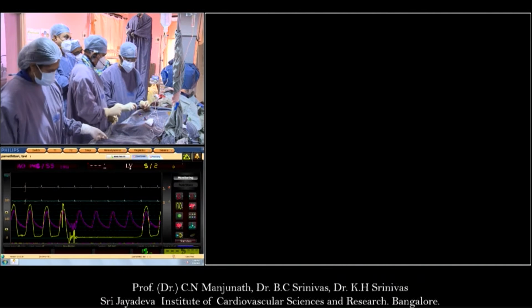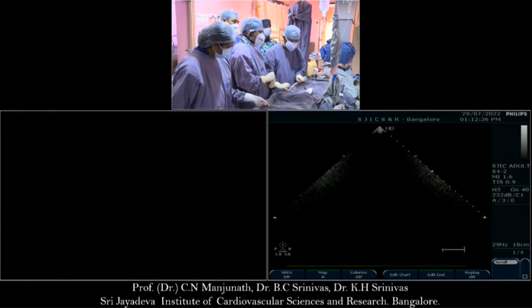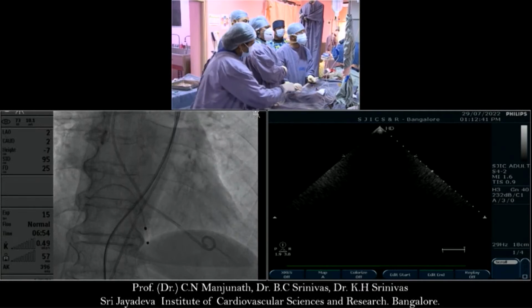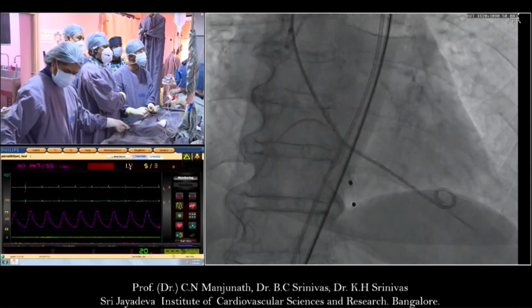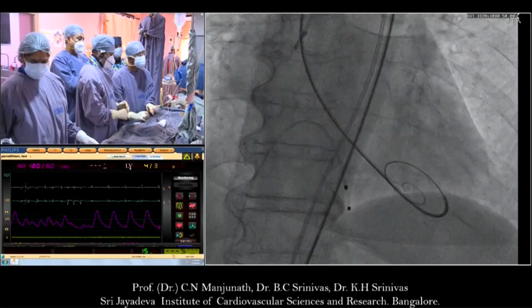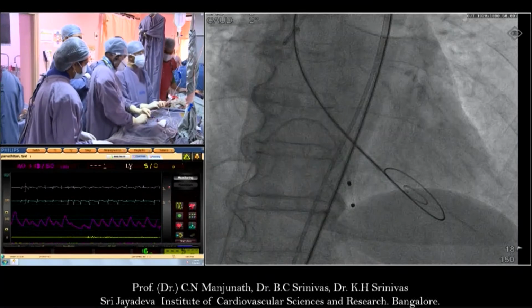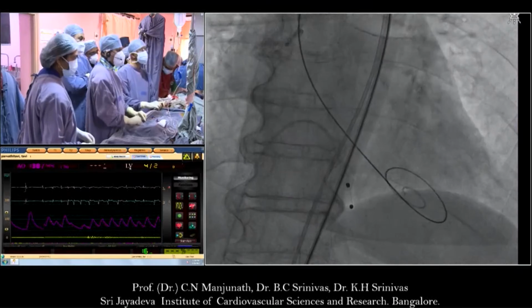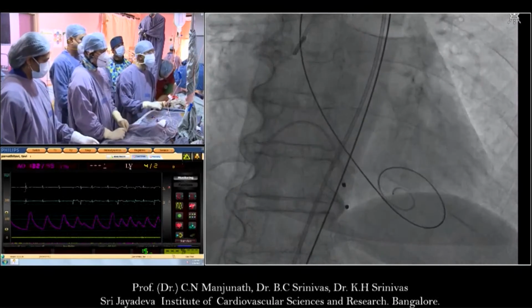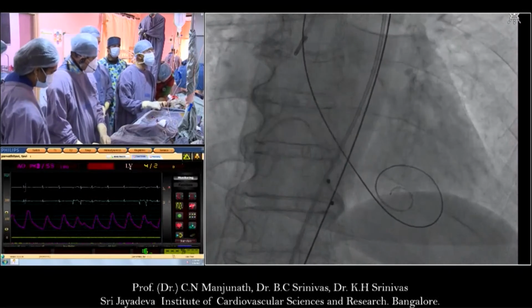Sorry, Ramesh, go ahead. Yeah, go ahead, Sushil, sorry. No, I'm just saying I think the hemodynamics are important in another way as well. You see the LVEDP, and it's low, so you know you have some time and room. If the LVEDP was 30, you would also know that you have to do short pacing runs. You might need to recover the patient. The hemodynamics really give you a lot of information that can help increase the safety of the procedure and shouldn't be ignored.